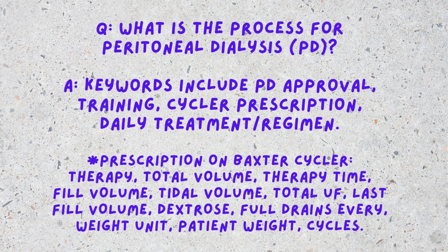They will also deliver, you will be given at the clinic a scale, a blood pressure machine, a thermometer, because you will have to keep your vitals daily. That is really important. So the peritoneal dialysis nurse is responsible for teaching you all this during training. And of course, if you have questions, you can let her know.